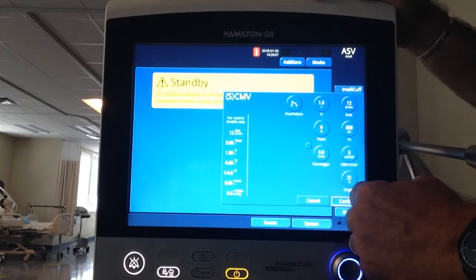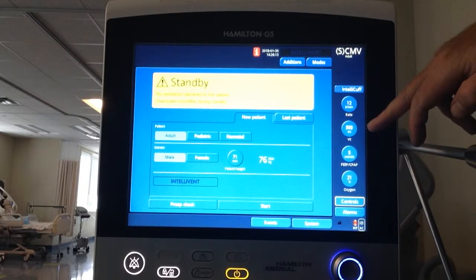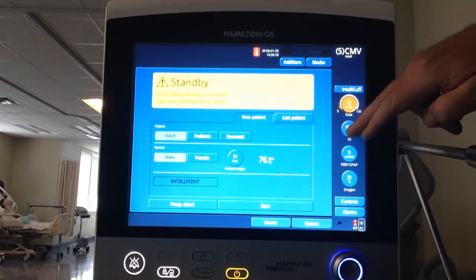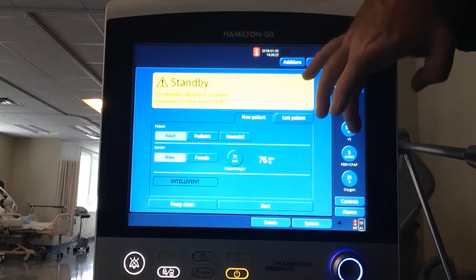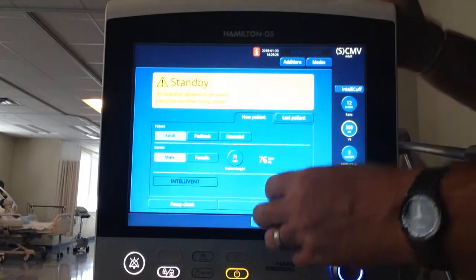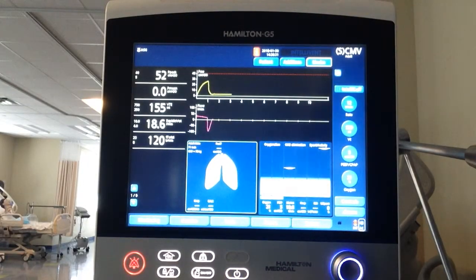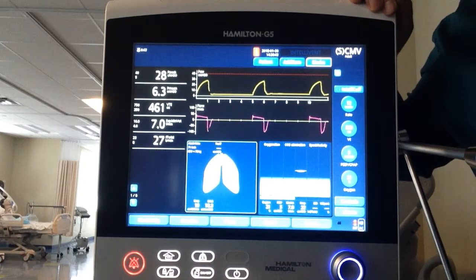Confirm, and it takes me back to my screen. I have my settings in: rate 12, tidal volume 500, PEEP 5. You can even change settings from over here on this side. Now I can start my ventilation. And that is setting up the adult SCMV mode.